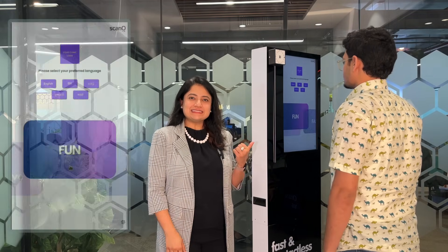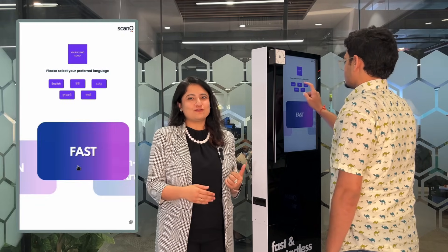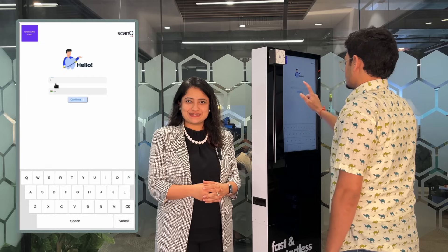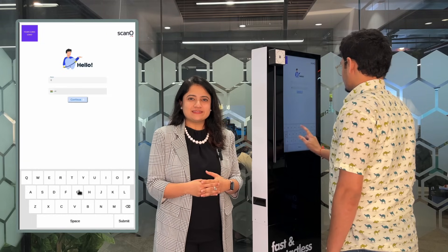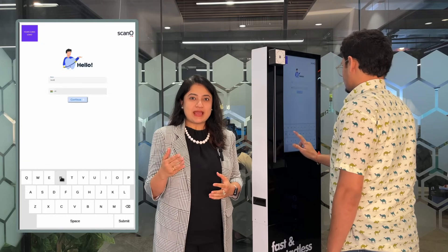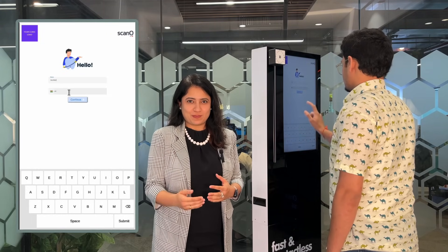When a patient walks in towards Scano Air, kept in your OPD or any public catchment areas, he can select the language of his choice. Then the patient enters the name and WhatsApp phone number.